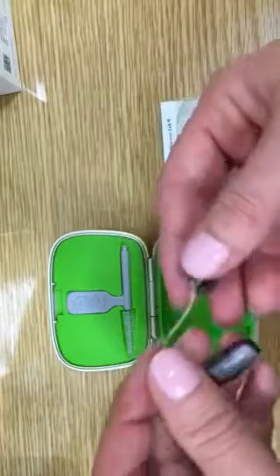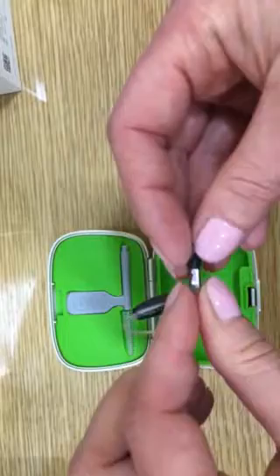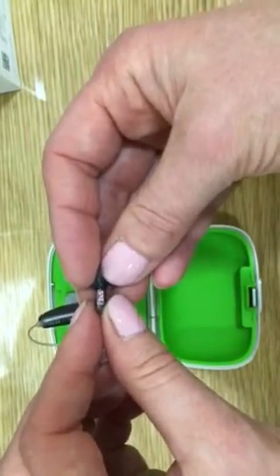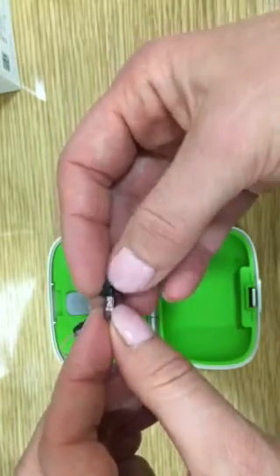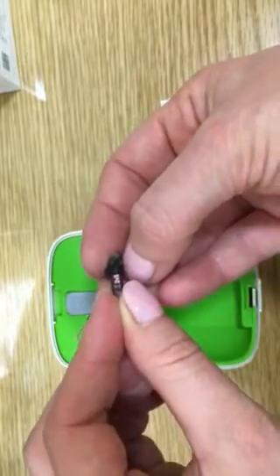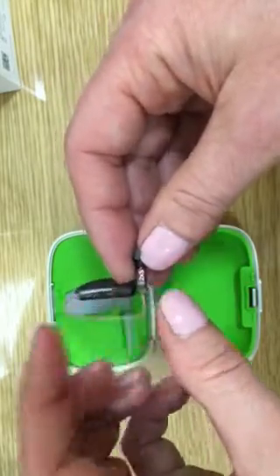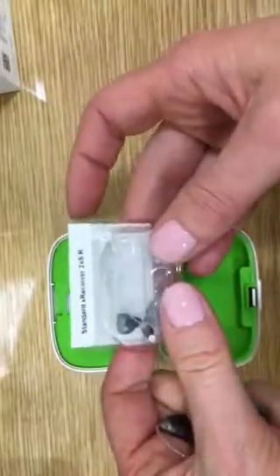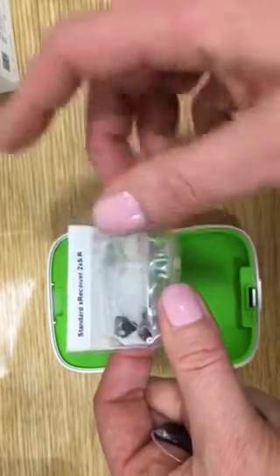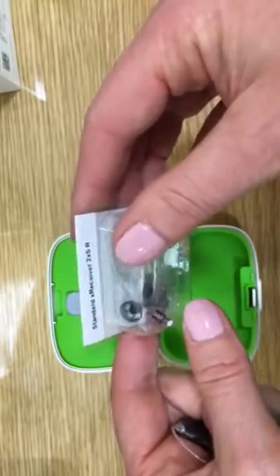Firstly we will make sure we are using the correct receiver. This is a size 2 receiver for the right ear. We know it's for the right ear as there is red paint indicating red for right. Here's our new receiver and we can see it's a size 2 standard receiver for the right ear, and again we can see through the box that the color is red.